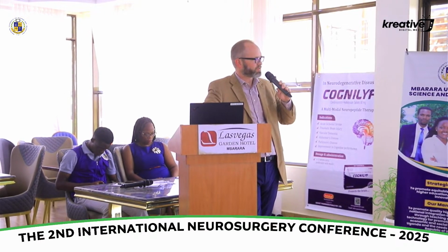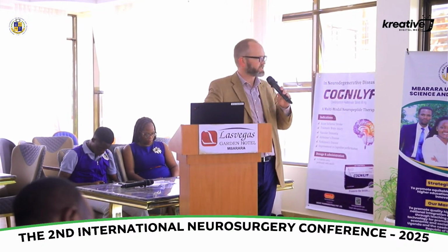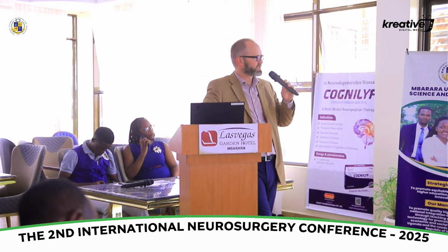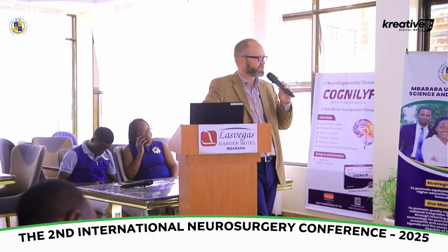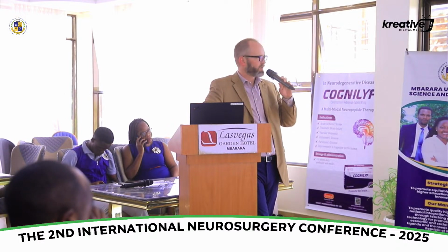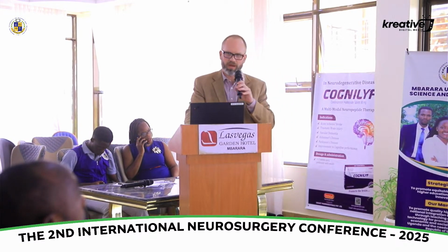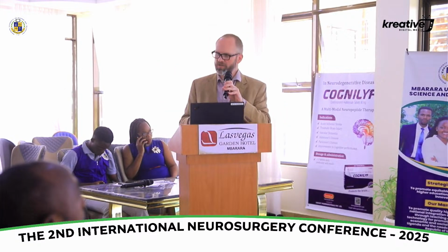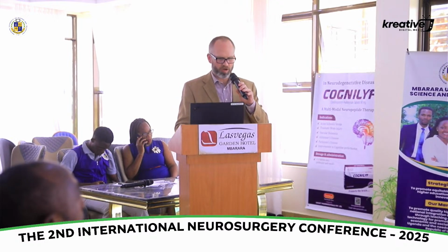understand basic ultrasound anatomy of the brain, using standardized approaches, orthogonal views. Ensure an improved understanding of what's being visualized, understand how pathology affects the echogenicity of various structures, learn how common artifacts lead to misinterpretation of imaging characteristics throughout the resection. The best way to learn that is to image frequently during a procedure. If you do that every time, you'll get better at recognizing artifacts.